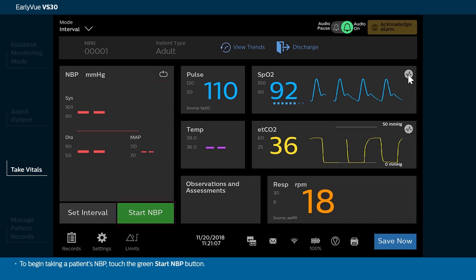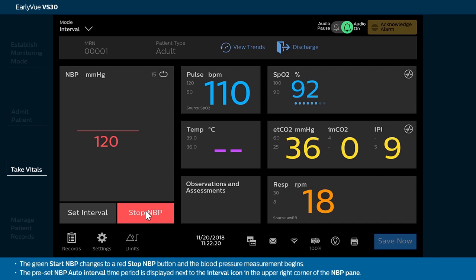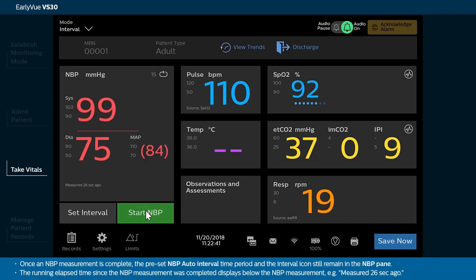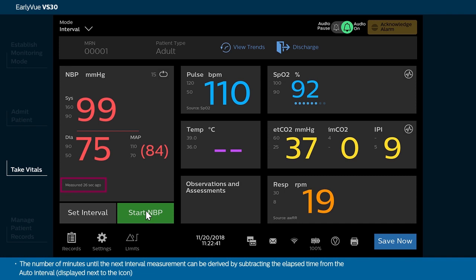To begin taking a patient's NBP, touch the green Start NBP button. The green Start NBP changes to a red Stop NBP button and the blood pressure measurement begins. The preset NBP auto interval time period is displayed next to the interval icon in the upper right corner of the NBP pane. Note, in continuous mode, interval icons will still remain in all continuous measurement panes while NBP is being taken. Once an NBP measurement is complete, the running elapsed time since the NBP measurement was completed displays below the NBP measurement — for example, measured 26 seconds ago. The number of minutes until the next interval measurement can be derived by subtracting the elapsed time from the auto interval displayed next to the icon.